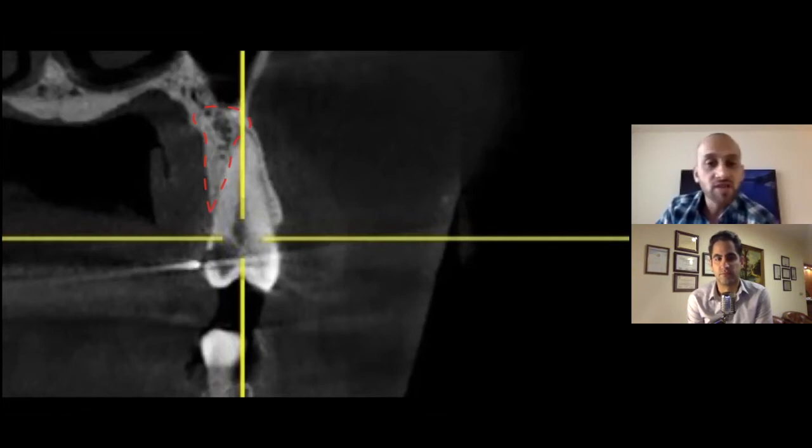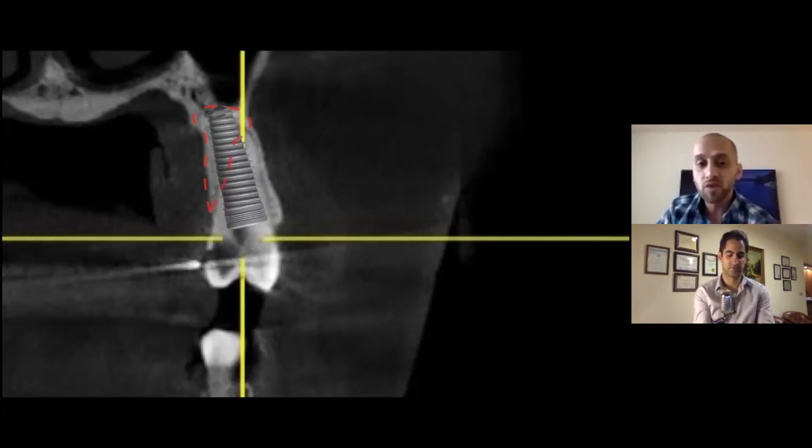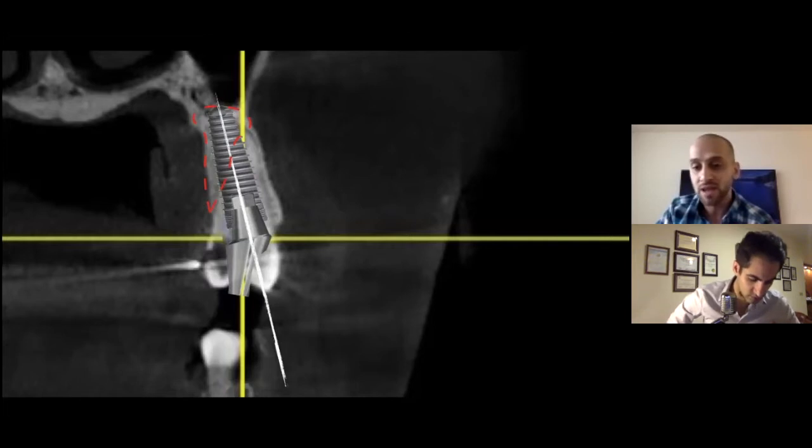And so in this x-ray, if you look, most of that bone is on the lingual, on the palatal side. And that is really the area that you want to be able to drill into and anchor your fixture. By doing that, you are sort of fixating yourself for a cement retained restoration. You have really no choice, because the way you have placed this fixture doesn't give you the ability to make a screw retained restoration. So what we do is we make angulated abutments. You make an angulated abutment and you fix that screw access hole, and you make the screw access hole come out of the central fossa.